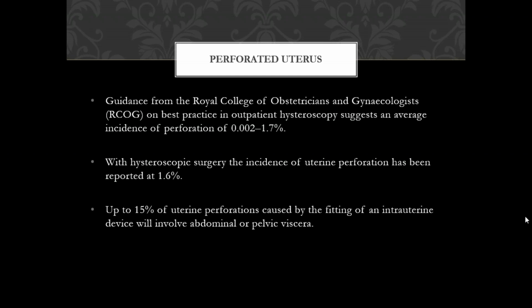If the question says hysteroscopy only, no, it's not requiring laparoscopy unless the size of the hysteroscopy port is more than 5 millimeters. The hysteroscope alone as a telescope is 2.7 millimeters, 3.4 millimeters with the inner sheath.